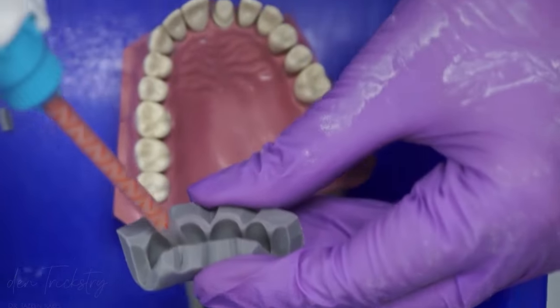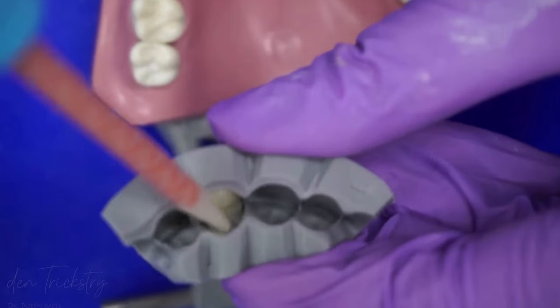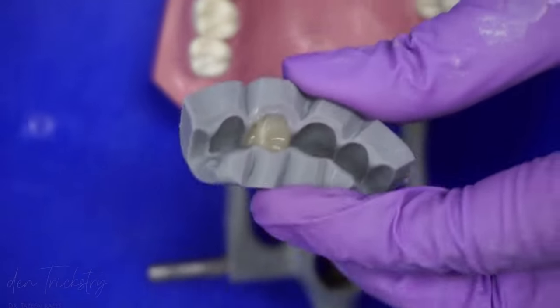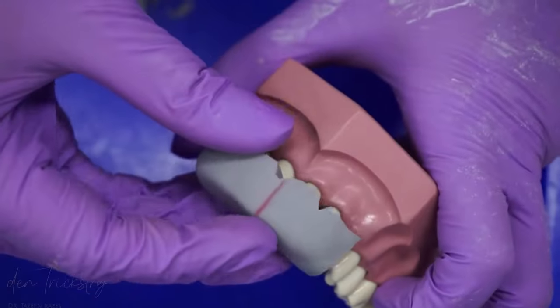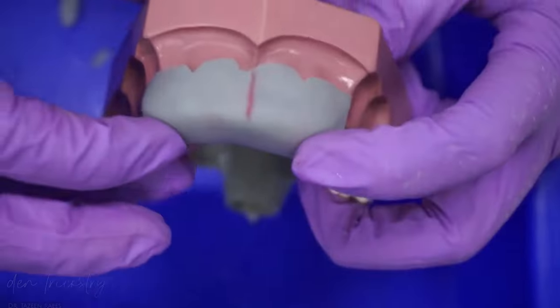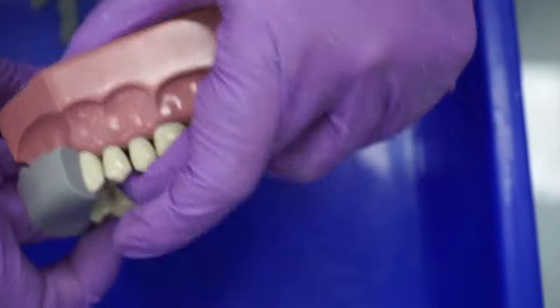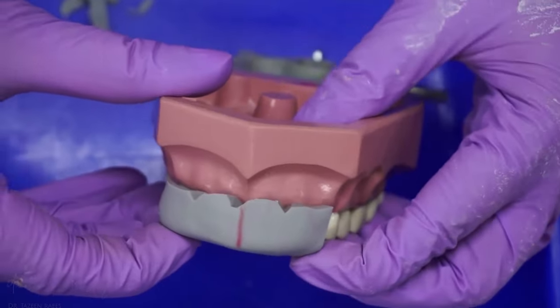Then go ahead with expressing the material into the index. Only apply the material for the tooth you want to temporize. In this case, the prepared tooth is our central incisor so placing material only in that area. Once done, quickly place the index on the tooth and make sure you position it properly.